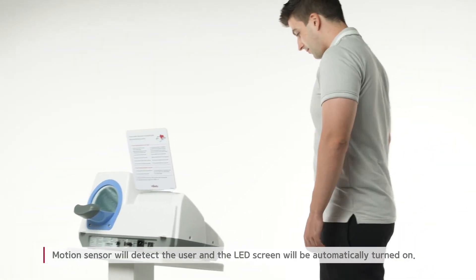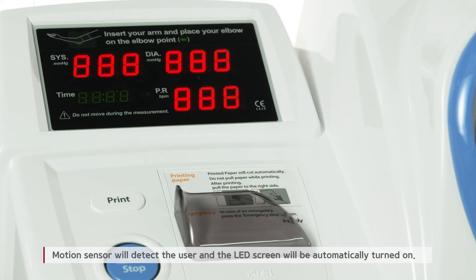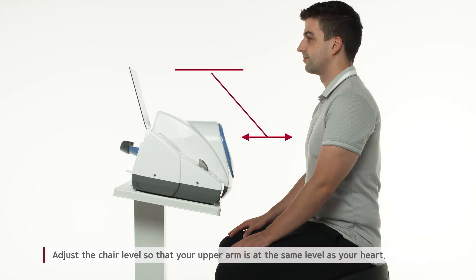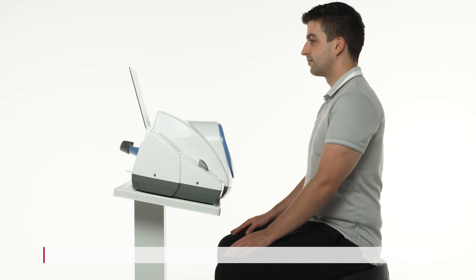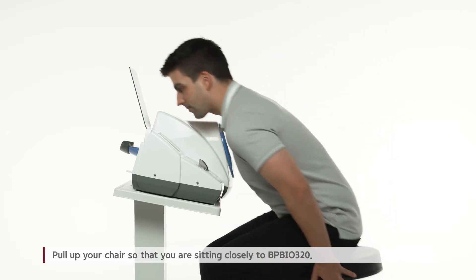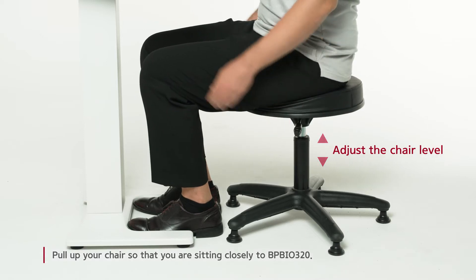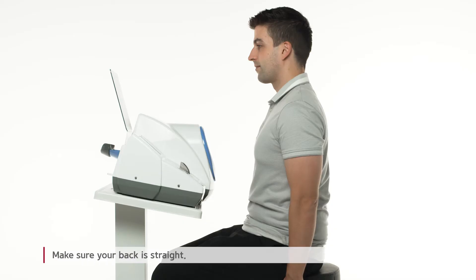The motion sensor will detect the user and the LED screen will be automatically turned on. Adjust the chair level so that your upper arm is at the same level as your heart. Pull up your chair so that you are sitting closely to BPBio320. Make sure your back is straight.